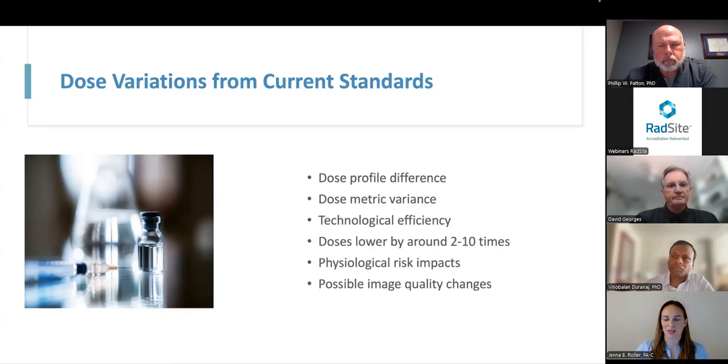The other thing that Dr. Patton mentioned is really that blend between dose and image quality and your diagnostic objective. In most of our scans, we really tailor our dose for bony anatomy. Compared to other applications in CT where they're using it for soft tissue diagnostics. In orthopedics, if you're looking for a soft tissue diagnostic, you're typically ordering an MRI instead. And so we've really honed in our dose parameters to balance image quality for bony resolution and focusing on that diagnostic profile. Sounds really good. Sounds really exciting.